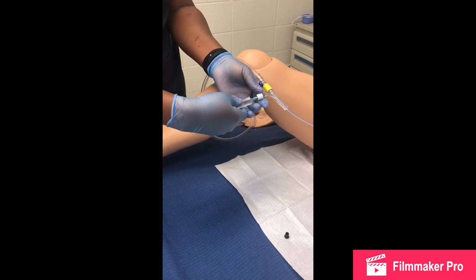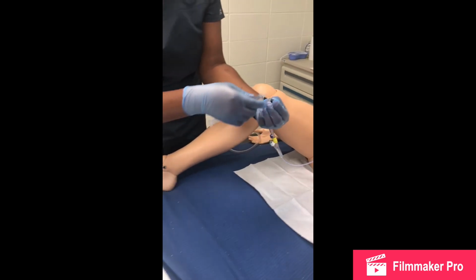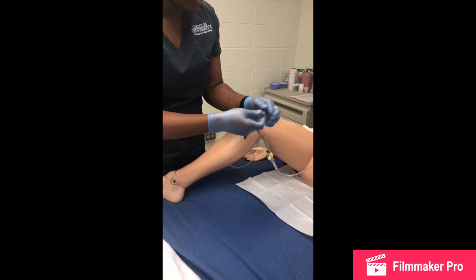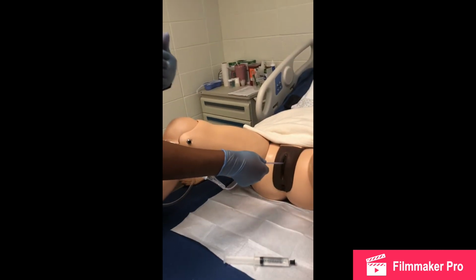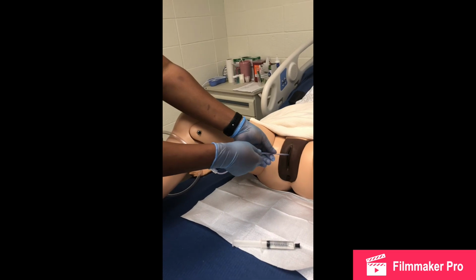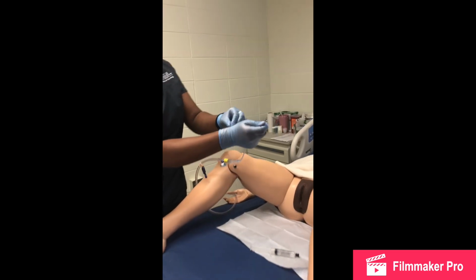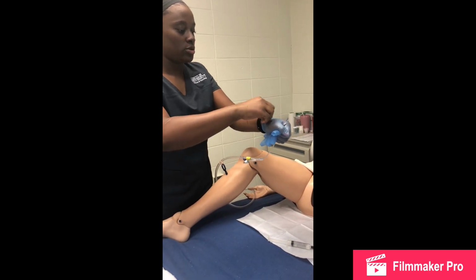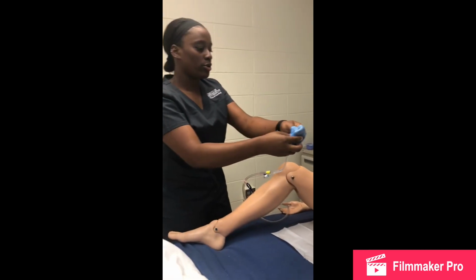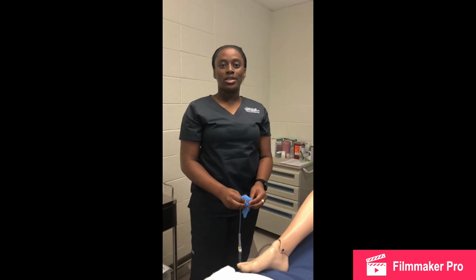So now that I've gotten all my fluid, I can carefully take this off, put this back on, rest this right here. Then I'm going to tell my patient to inhale and exhale while I carefully pull this out. Then I'll wrap this in my gloves, take my gloves off, just to prevent it from flashing back and forth. Then I'll put it in the dumpster. And that will be it for the removal of a Foley catheter. Thank you.